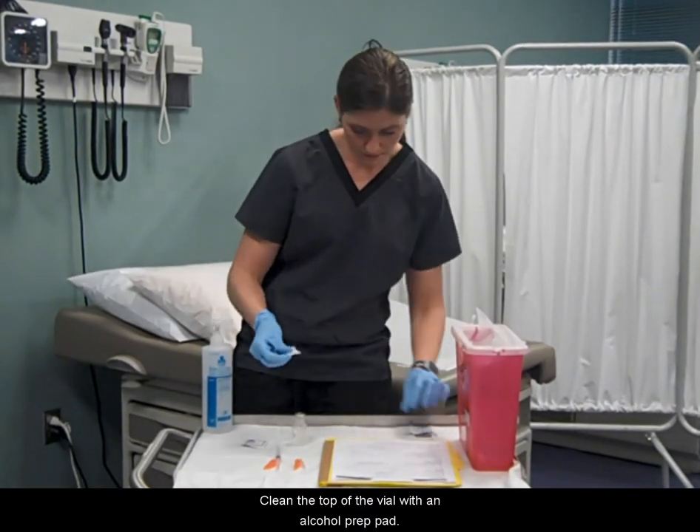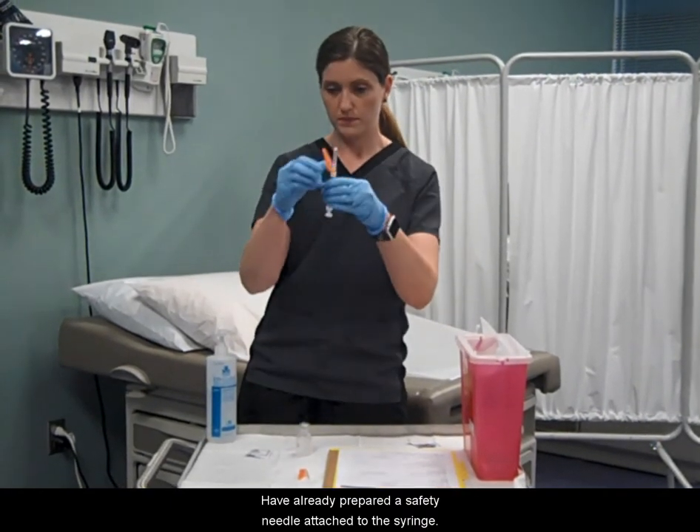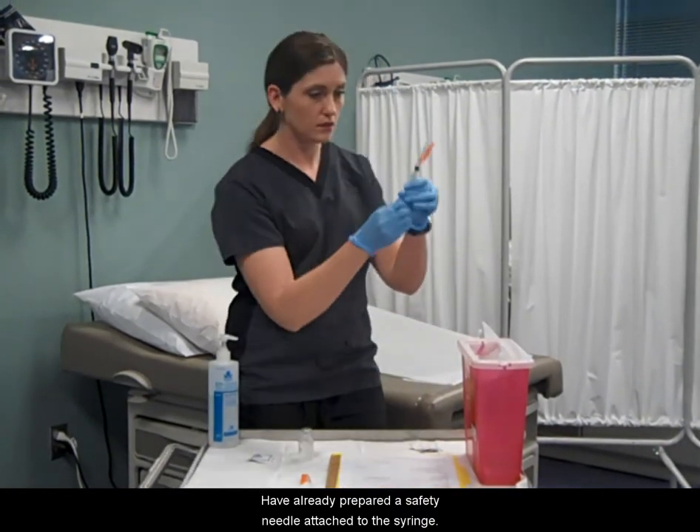Clean the top of the vial with an alcohol prep pad. Have already prepared a safety needle attached to the syringe.